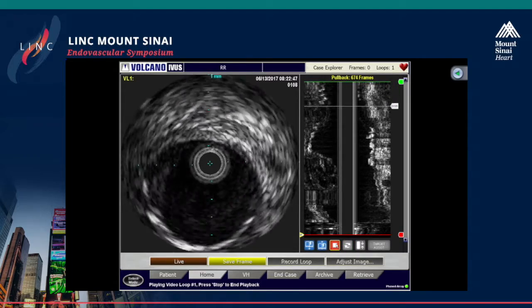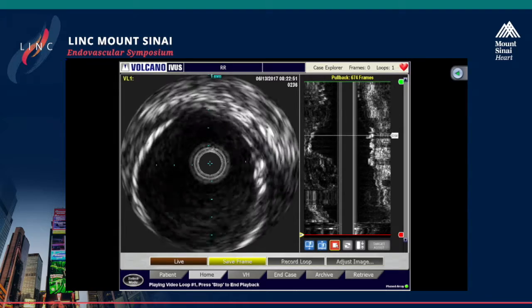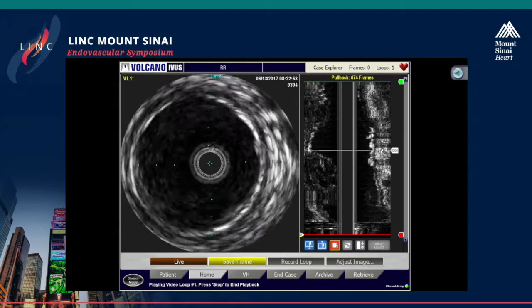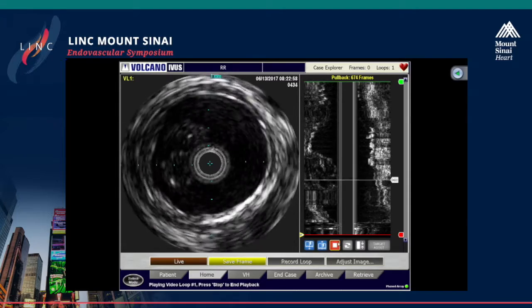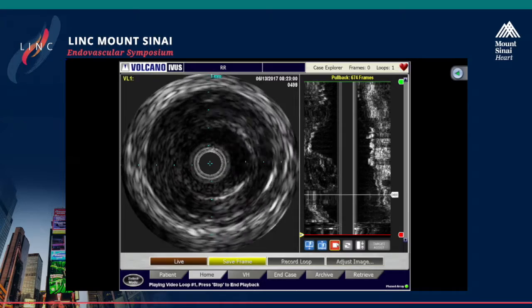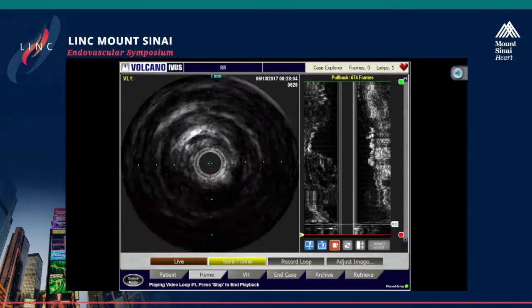The artery is really very, very healthy looking. And you have some areas of plaque. Obviously, she does have PAD with the occluded posterior tibial, some diffuse calcification, and then you can see there seems to be a rent in the artery with a dissection. And then you can see followed by what looks like possibly thrombus or occlusive disease, explaining the symptoms that she has.